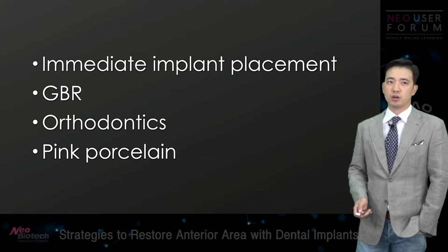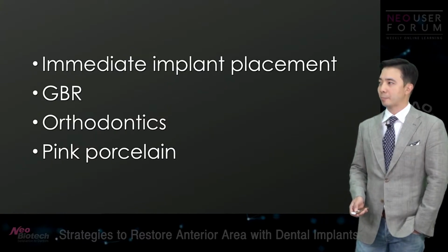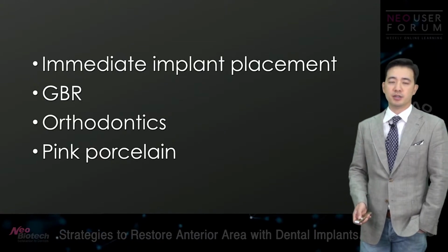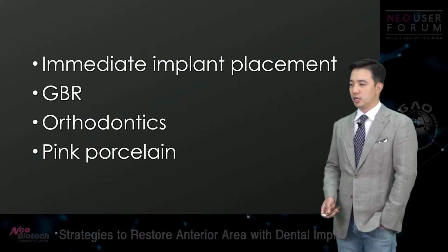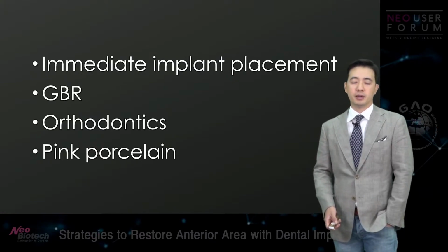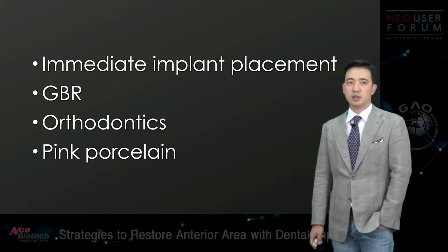We're going to talk about some of the cases along the presentation. And of course, pink porcelain is another option. You just cannot restore, let's say, papilla under certain circumstances.